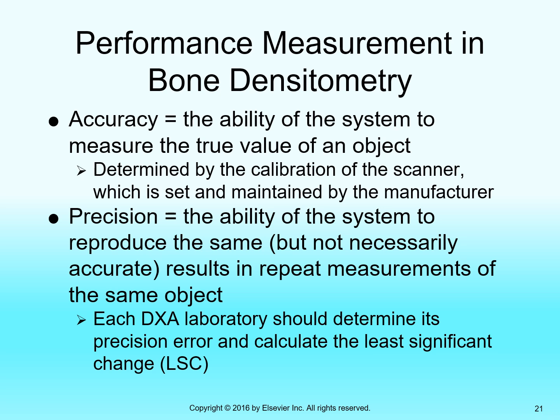So anytime you're conducting a measurement and you repeat the measurement and your result varies wildly, that leaves you with doubt as to, okay, how good am I doing this measuring? You see what we're saying? So precision is just as important as accuracy. Okay.